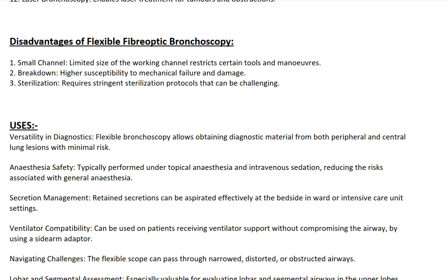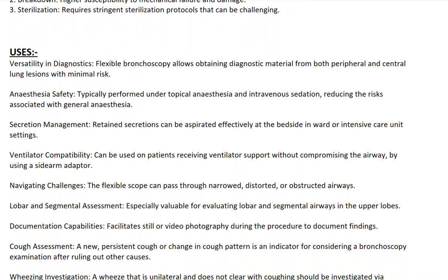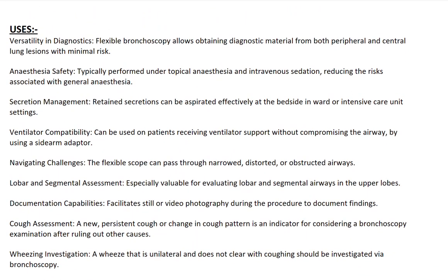1. Versatility in diagnostics. Flexible bronchoscopy allows obtaining diagnostic material from both peripheral and central lung lesions with minimal risk. 2. Anesthesia safety. Typically performed under topical anesthesia and intravenous sedation, reducing the risks associated with general anesthesia. 3. Secretion management. Retained secretions can be aspirated effectively at the bedside in ward or intensive care unit settings.